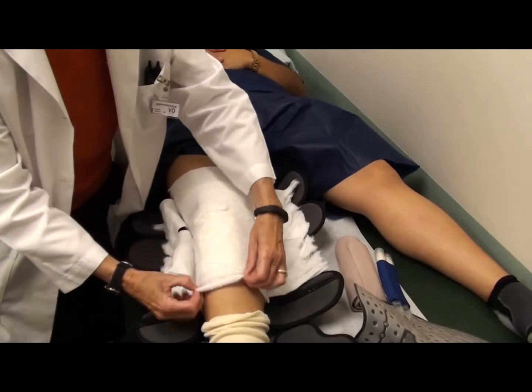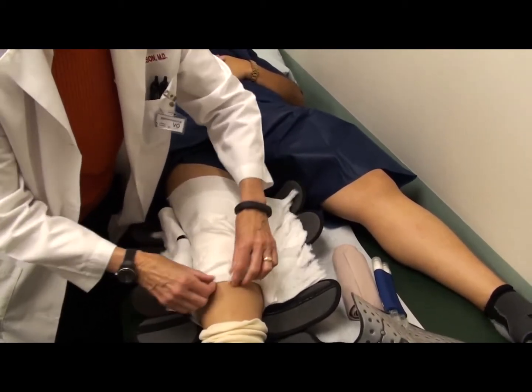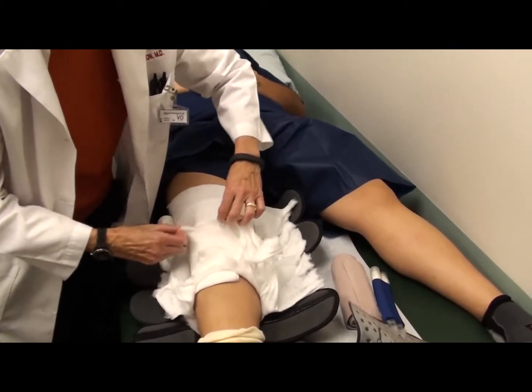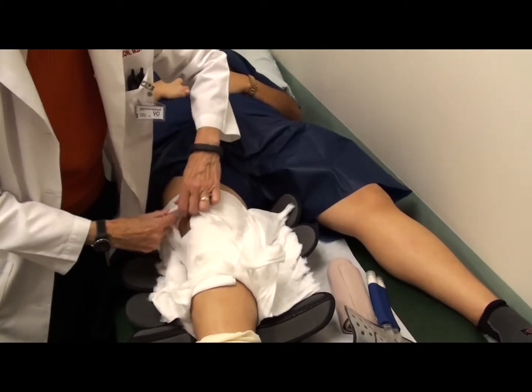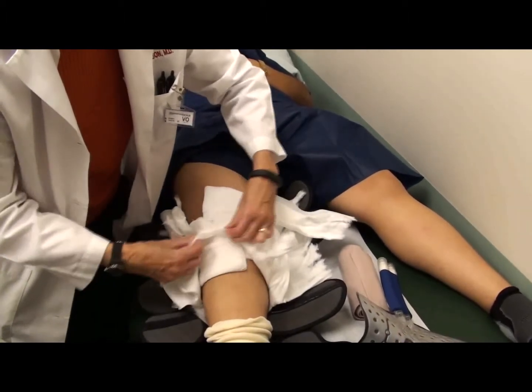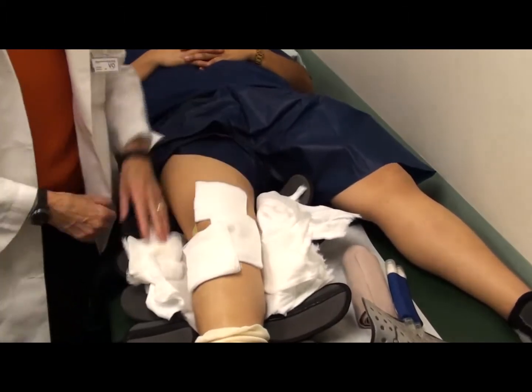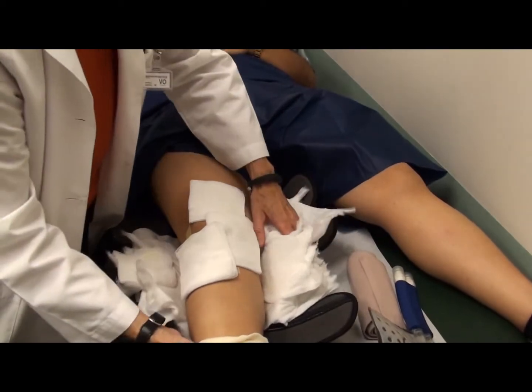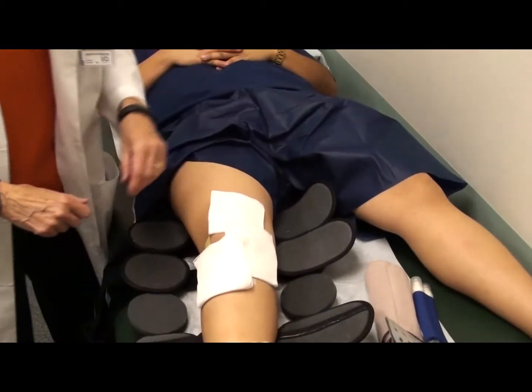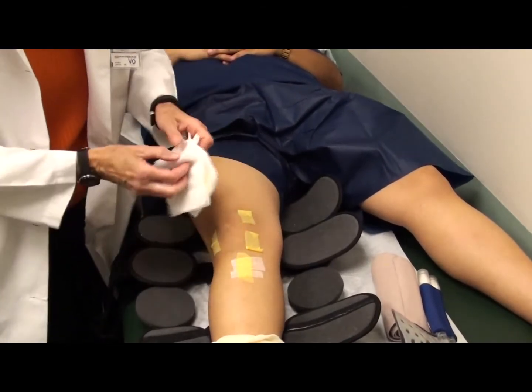Under the pad will be another layer of this cotton padding. So again, if you have a pair of scissors, you can cut it off, or it's very soft and it just pulls apart very easily. For purposes of our demonstration today, I'm just going to pull it apart. Now, when you get down to the final layer, you'll have some 4x4 gauze dressings. At this point, I generally would just slip out the dirty dressing and put it in the trash because you're not going to use that again. So these gauze pads come off, and then you're down to the incisions.